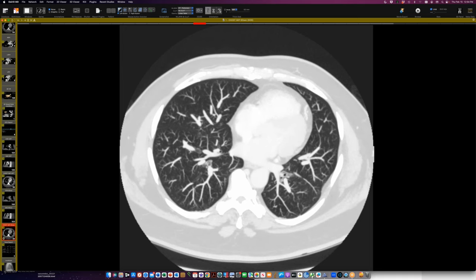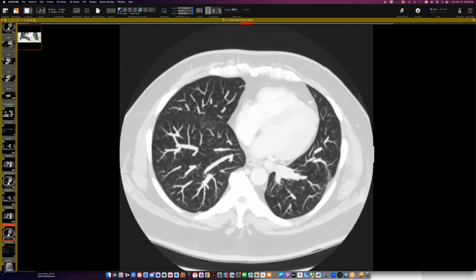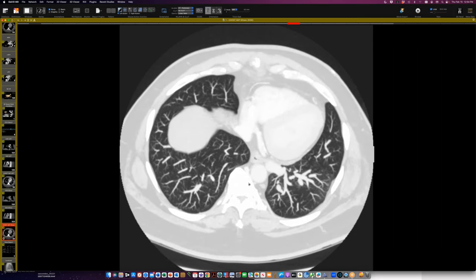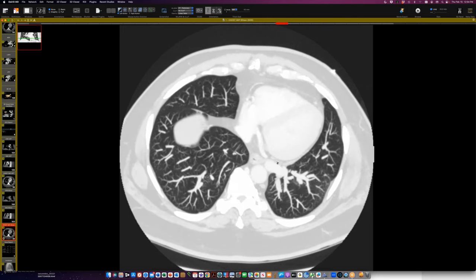We can track the pulmonary artery down — the big branches go off laterally and not much goes posteriorly — then this systemic vessel comes in and basically fills in the course that the left pulmonary artery would normally follow, completing perfusion to the lower lobe. It's not supplementing; it's actually replaced the pulmonary artery in that area. I'm really glad Jeff's on board with this case — I hadn't recognized this as replacing a segment of pulmonary artery.